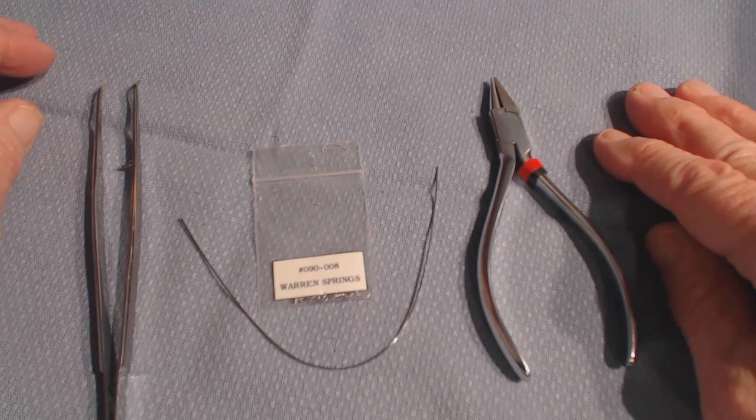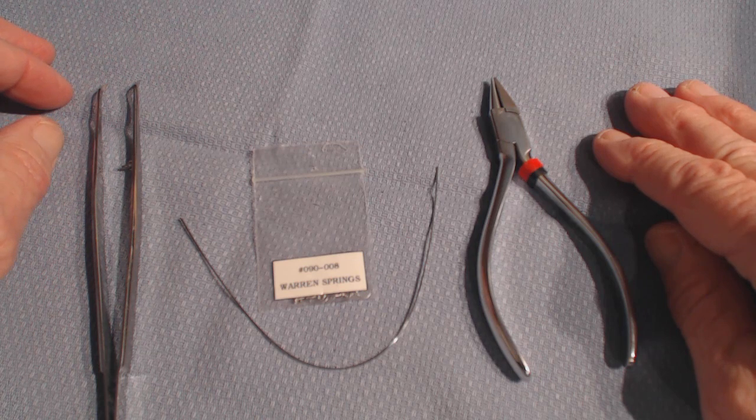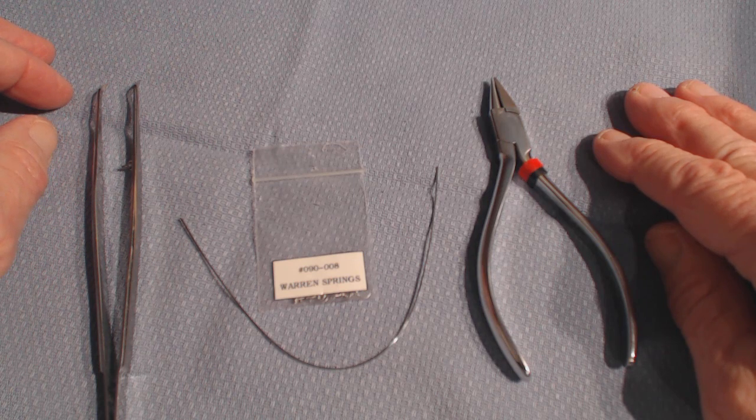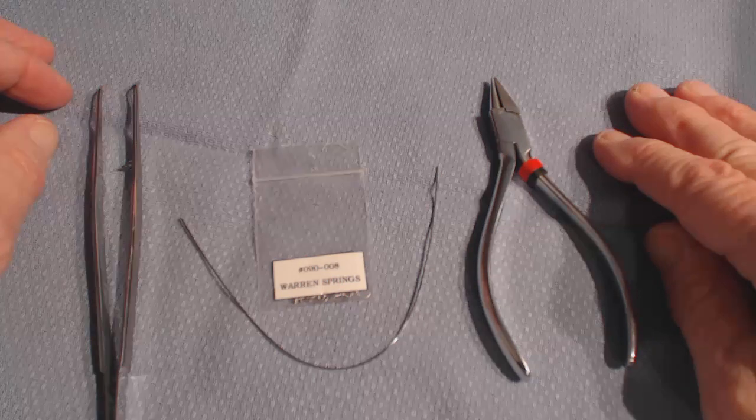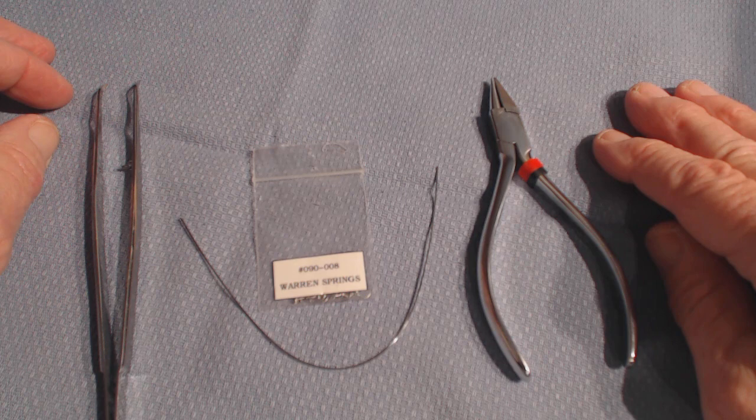It's way better than trying to cause a twist in an arch wire, because 19 by 25 is way too strong, and it's not an effective torquing arch, if you will. This works much better because it has such a longer lever arm than your twist in the wire.